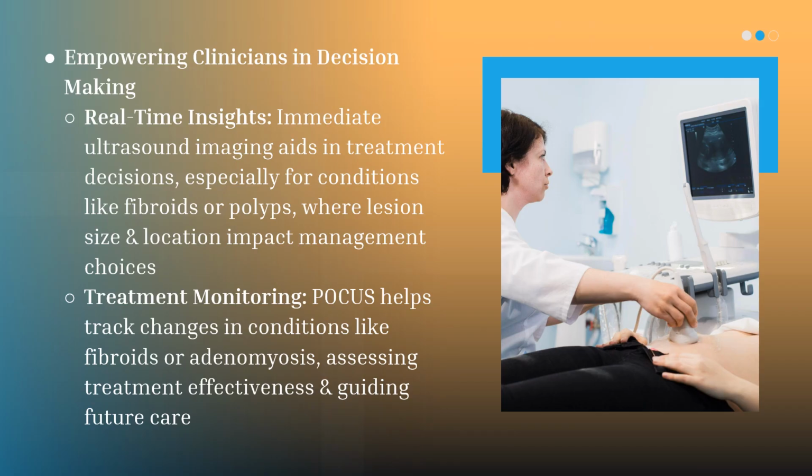This helps clinicians give strong decision-making answers, versus telling your patient, I don't know, we've got to wait until the ultrasound results. You can really determine, here's your uterus, look at the screen with me, here are your ovaries, here are your fallopian tubes. Your uterus looks normal and healthy, or there's this suspicious area here that I suspect is a fibroid, and we should get you to the appropriate people to continue management.